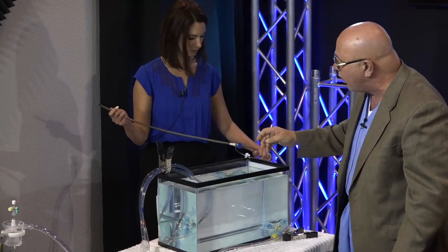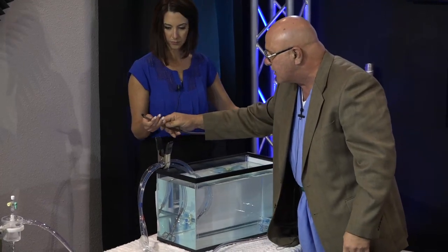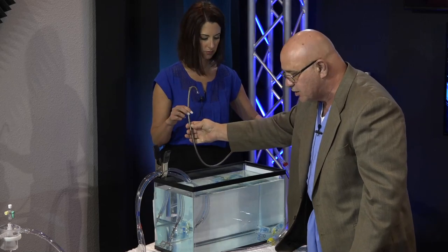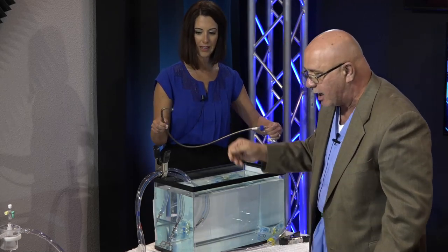And the reason why is because now that they have this Gen 3, you can see that we're going to be able to make this turn to get through the tricuspid valve and up past the pulmonary valve into the pulmonary artery. So you have that. You might want to make that straight because we have to prime it. I had it straight. Okay.